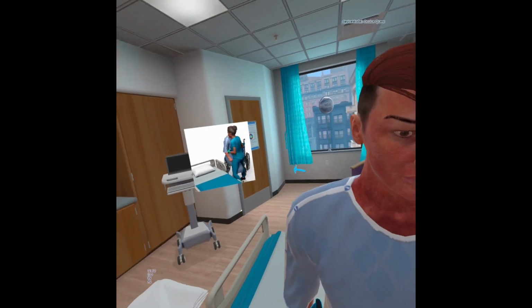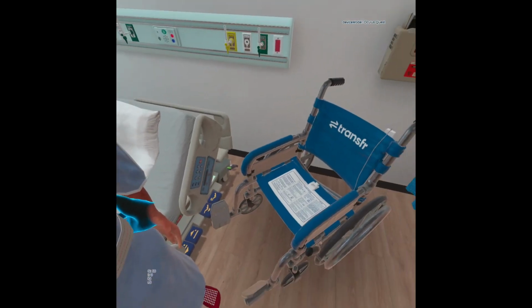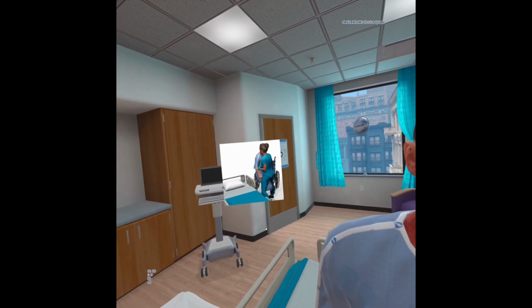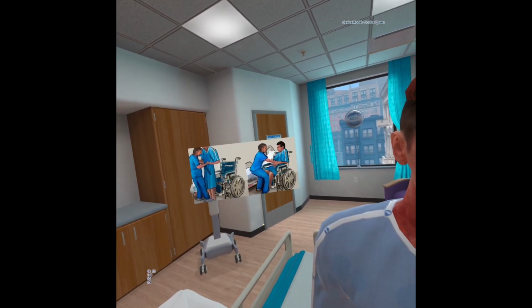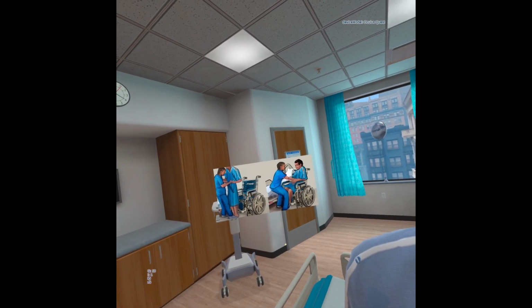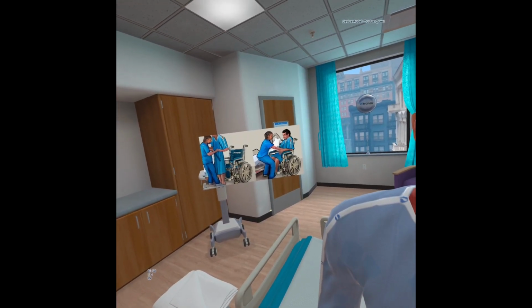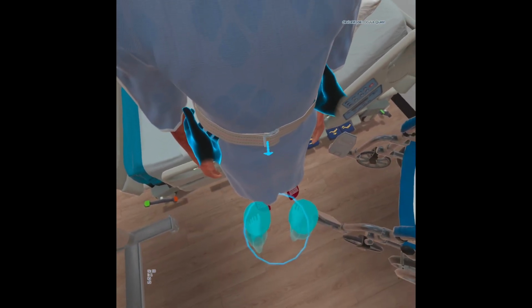Watch the healthcare provider's body position as they help the patient into the wheelchair. Their knees are in line with or just outside of the patient's knees. They pivot on their left toes with most of their weight on the heel of the right foot. You'll pivot on the toes of your left foot with most of your weight on your right heel. When you complete the pivot, your left foot will be slightly behind the right to counterbalance yourself as you hold on to the gait belt. Position yourself correctly before you pivot.